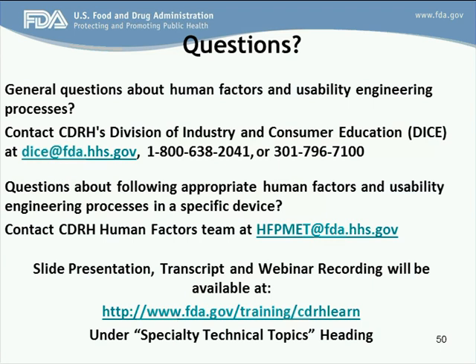So when we're looking at high severity harm, again, it is subjective because risk management is a bit subjective. A lot of times it uses numeric quantification, but it is a bit of a pseudo-quantitative process. It's a qualitative process of understanding risks. And so as you're looking at high severity harms, we're looking at the standpoint of is the device safe and effective, can a clinical harm be created by a misuse or an error in the use of this device? If not being treated could have a harmful clinical outcome, then that may be something else that flags that perspective. But again, it's looking at the overall risk of the device and understanding what aspects of that device, where a misuse or a use error could cause that clinical harm, that high severity harm.